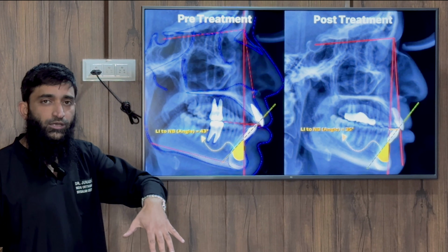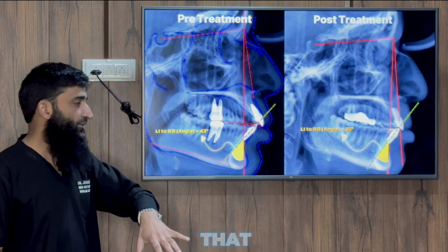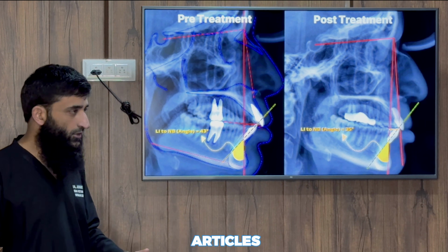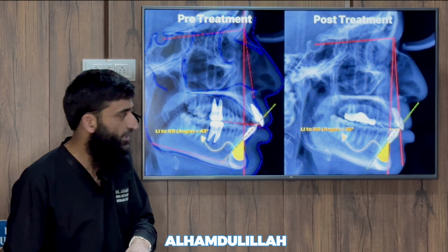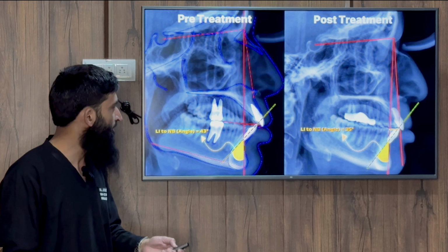according to Graber, he says that the tipping movement and the intrusion movement, there are conflicting articles. It can worsen the case. More amount of bone loss can occur. But Alhamdulillah, this case settled well. There was no further bone loss.